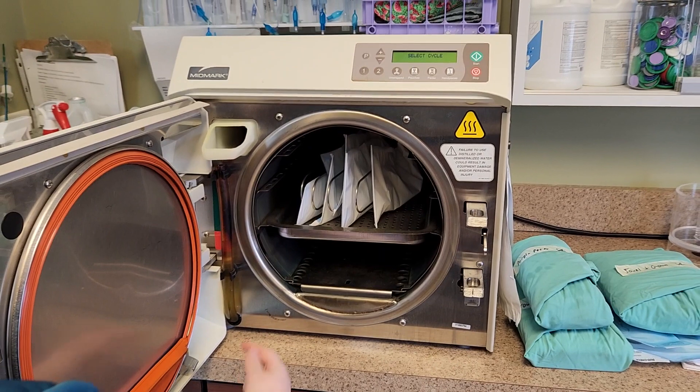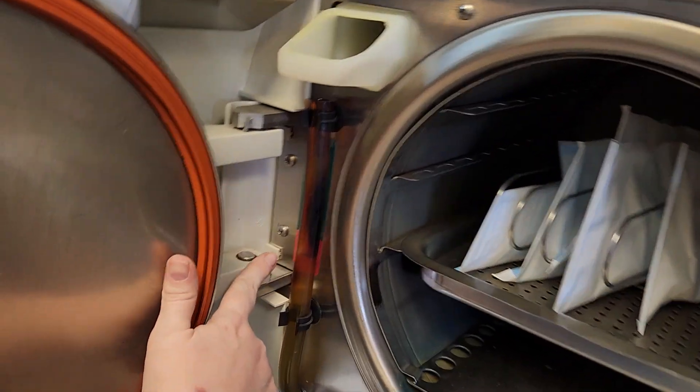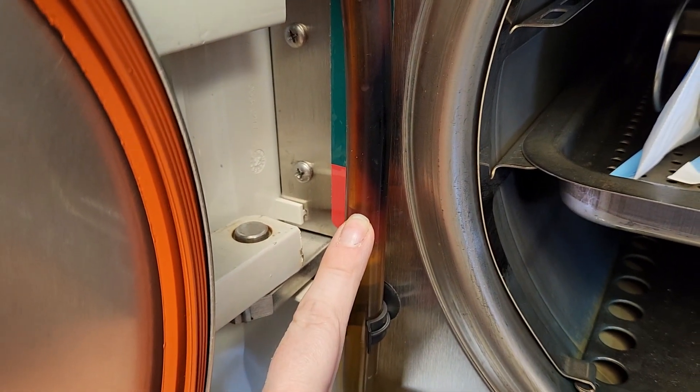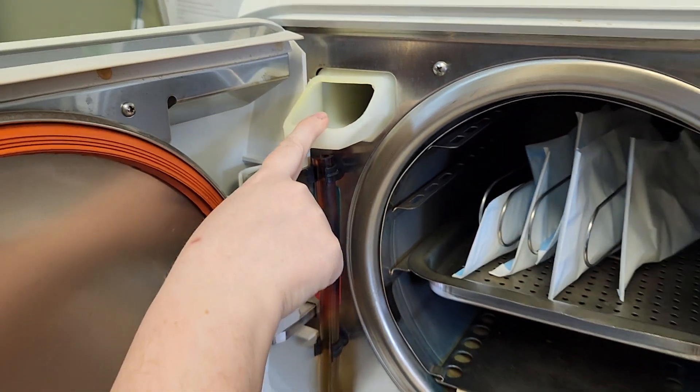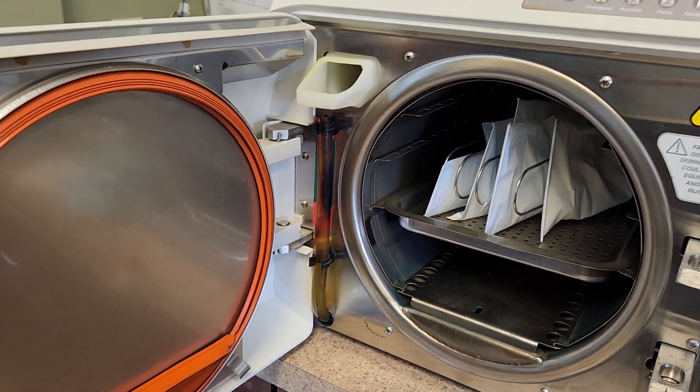Also, before you run it, you want to make sure and check your water levels. You've got your green area as well as your red area. As you can see right now, it's in the red. So we're going to put some more distilled water into this opening and fill it up into the green.